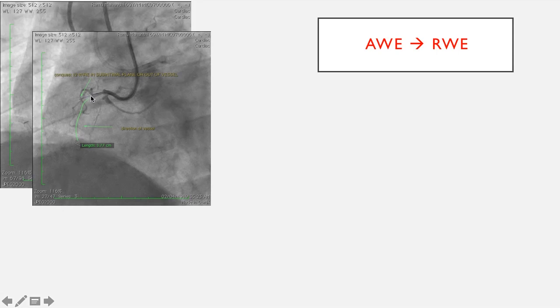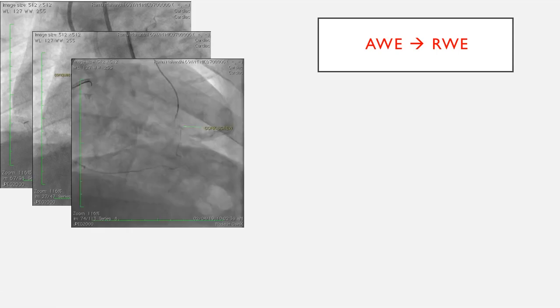It is perforated and gone out of the vessel. So at this stage, I immediately shifted to retrograde approach. I have chosen first septal collateral because that is sitting proximal to the lesions, and it reduces the possibility of donor vessel ischemia. But as the takeoff of the first septal is very abnormal, we couldn't enter into first septal, so that's why I went into the third septal.